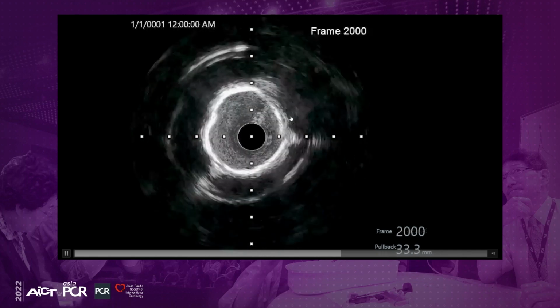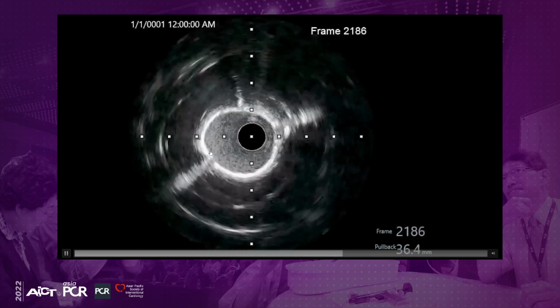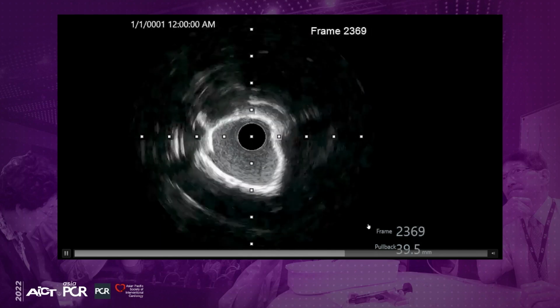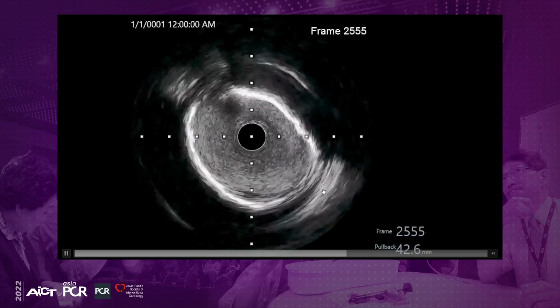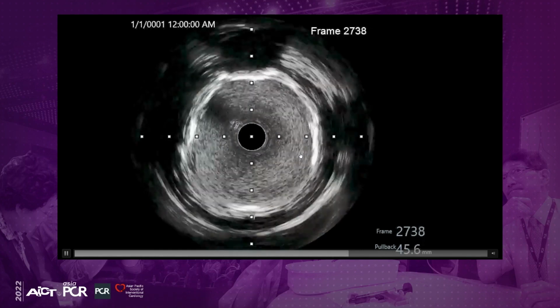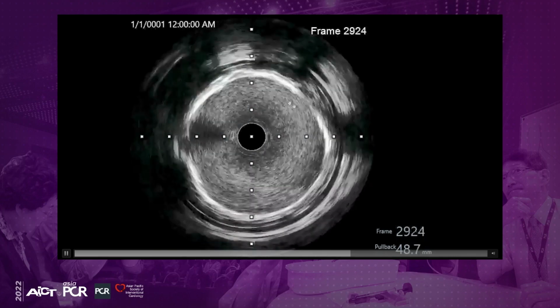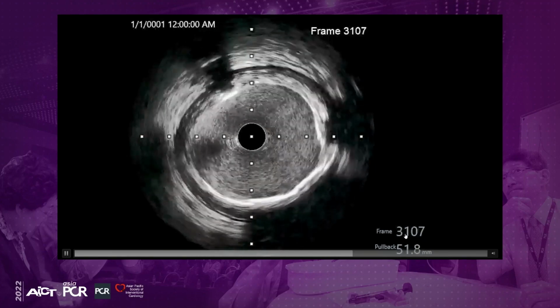While you can still see the circumferential calcium, you can see that there are areas of fracture along the vessels. And this is really what you want to achieve, because if you do not achieve adequate fracture of the calcium, you're not going to be able to expand the stent that you plan to deploy. The vessel is actually huge proximally.